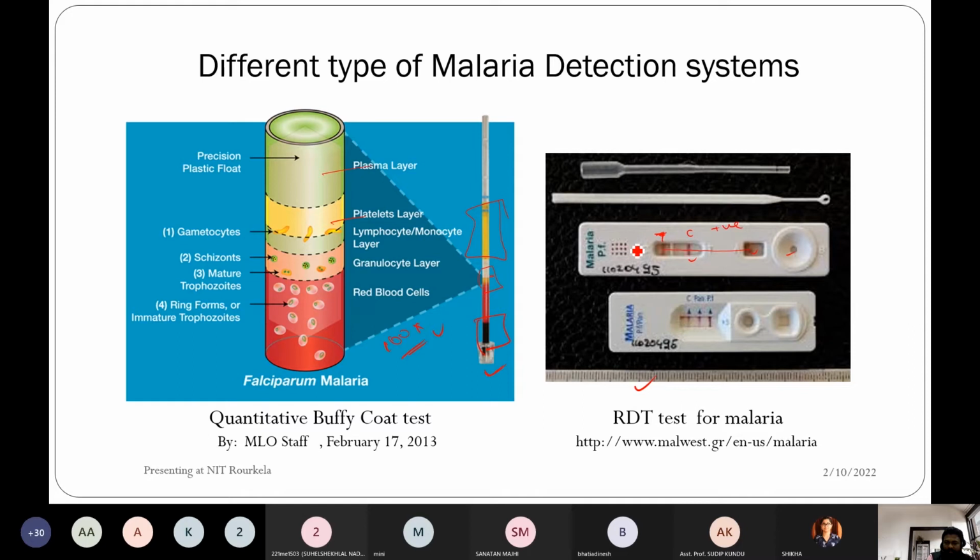And this is the outlet, right? Outlet means when your sample is inserted from here, that sample will come out or be stored here. So anyhow, if you open this case, you will find a simple strip, which is actually called a paper based microfluidic. So whatever you are using here is the paper based microfluidic.